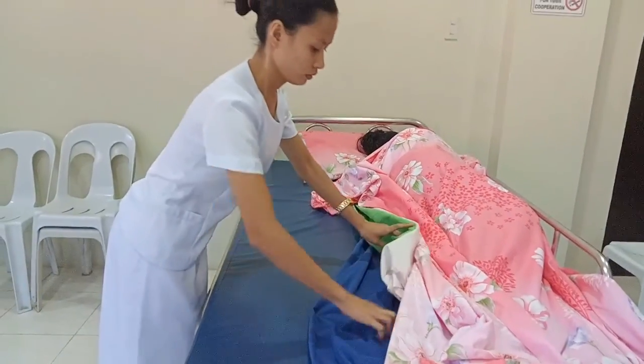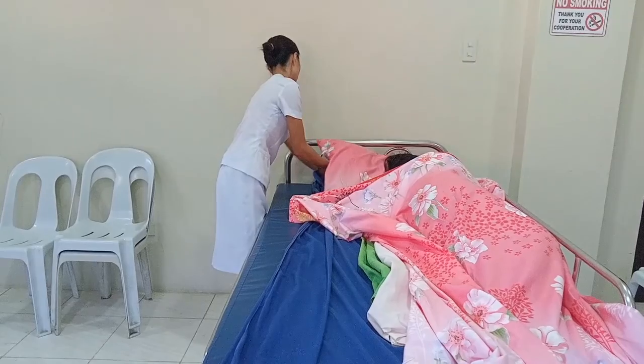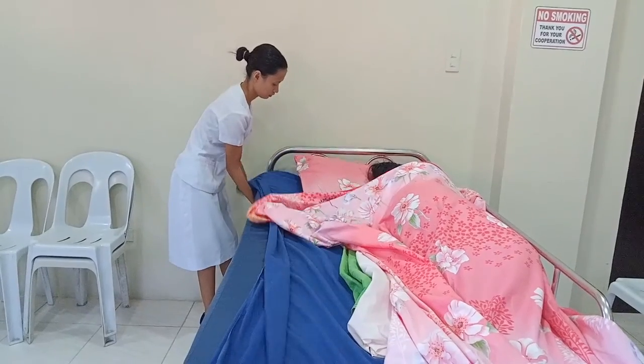Unfold the fan-folded bottom sheet from the center of the bed. Facing the side of the bed, using both hands to pull the bottom sheet so that it is smooth and tuck the excess under the side of the mattress.